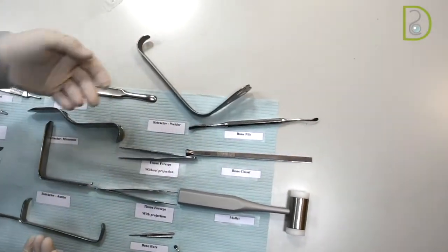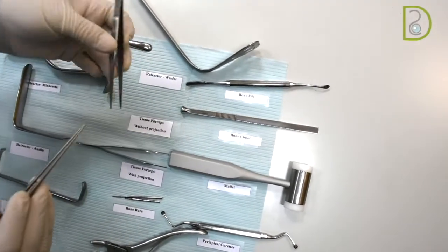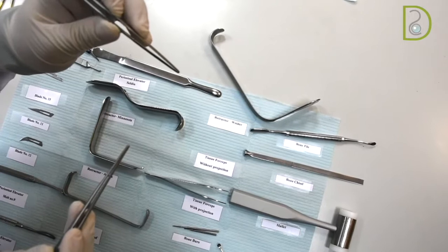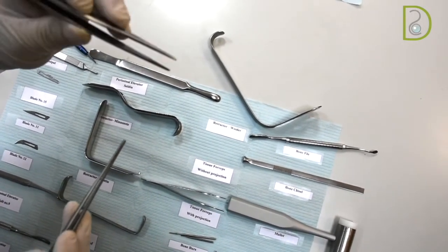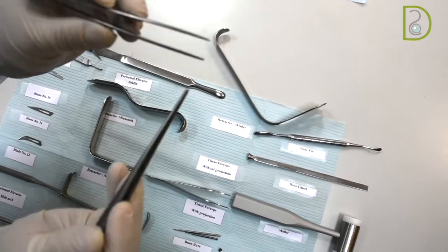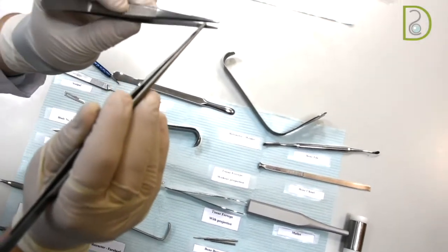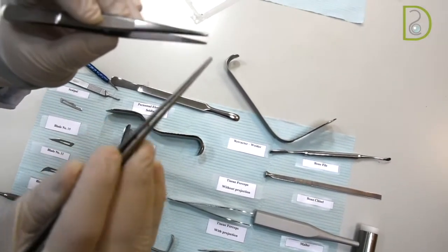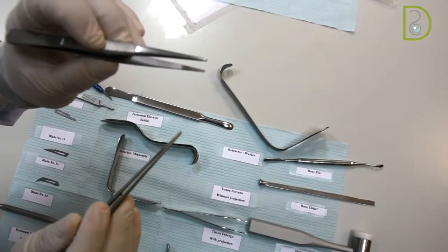Now we'll talk about the forceps. Tissue forceps are good for holding the tissue. Let's say, for example, in suturing time or in biopsies, you can use the one that is without a projection, and you can see there are horizontal lines within the teeth to ensure that there will be no slippage of the tissue when you hold it.